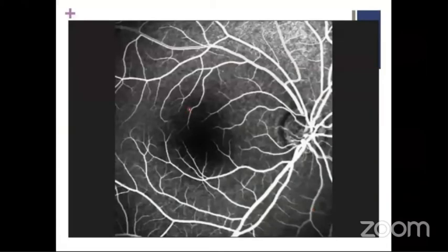This is a normal FFA image of a right eye, showing a slow gradual tapering of the vessels in the macular region, leading to no vessels, the foveal avascular zone, in the central 300 microns.